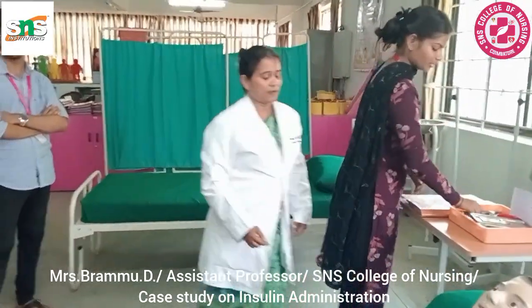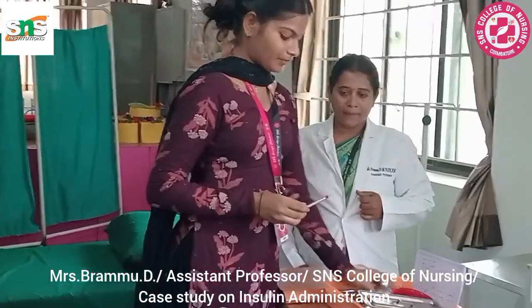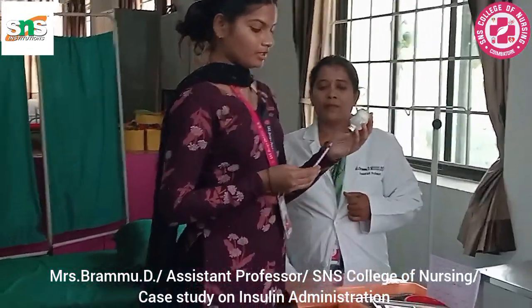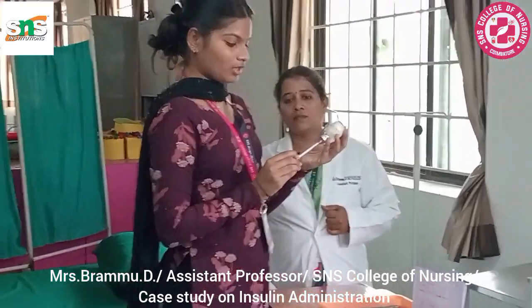Next, we need to take the insulin needle and take off the cap, take the vial and place it upside down, insert the needle and load according to the doctor's prescribed order of insulin units.